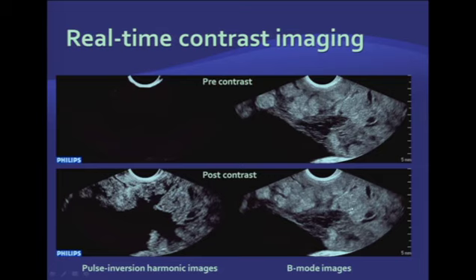They're going to be almost as bright as background tissues, and they're almost undetectable to normal observer. But using different contrast enhanced detection techniques, you can filter out your normal base frequency, you can filter out your entire volume of normal tissues and only detect microbubbles.